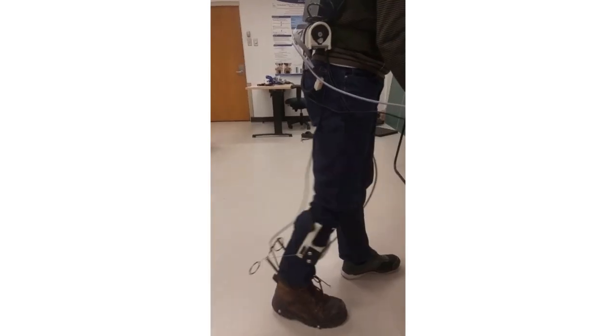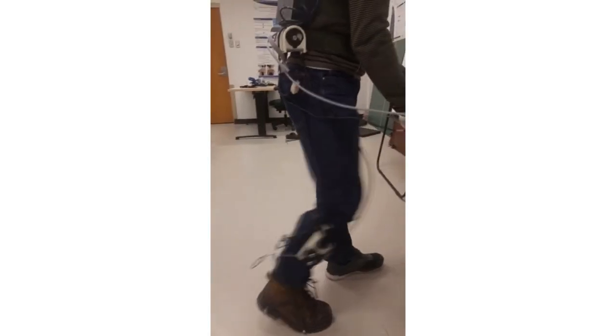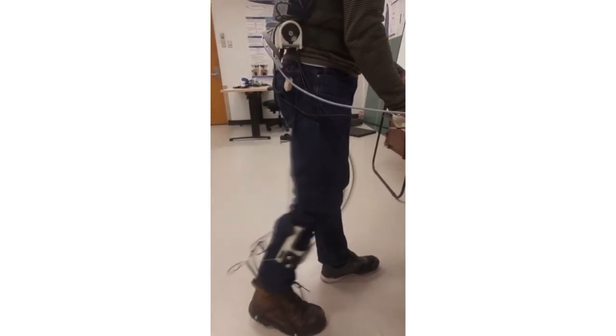Our exoskeleton creates an assistive plantar flexion torque during the gait cycle. When the user arrives at a specific timing during the gait cycle, the motor rotates, pulling the two cables, which themselves pull the strut assembly that is affixed to the boot. As the strut assembly is moving upward, it adds mechanical power to the ankle joint of the user.